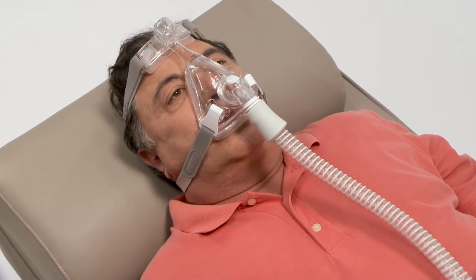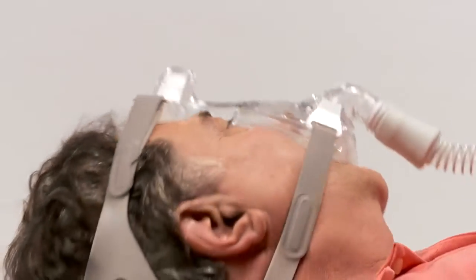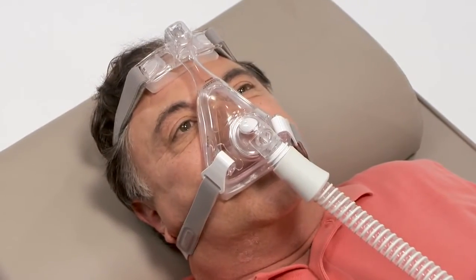With your air pressure at the prescribed level, turn your head from side to side and identify the areas that leak and that may prevent the ability to sleep. In the event of leaks, there are various recommended methods to obtain a better seal.